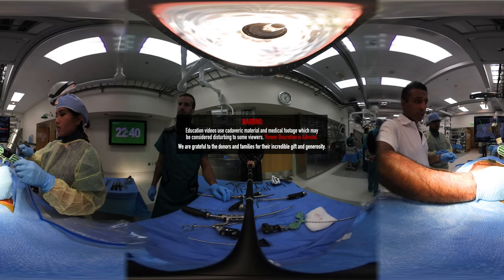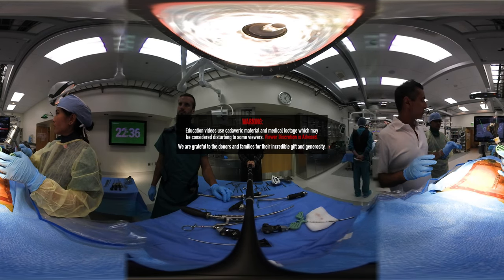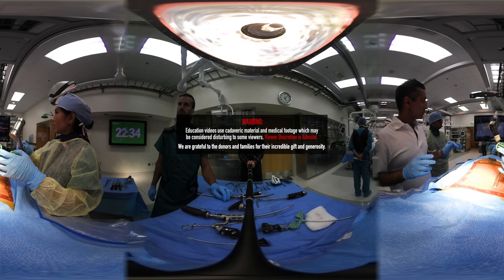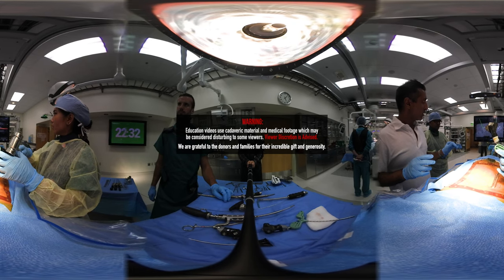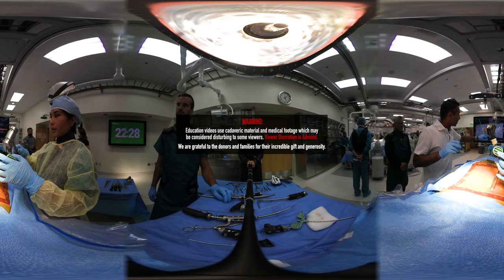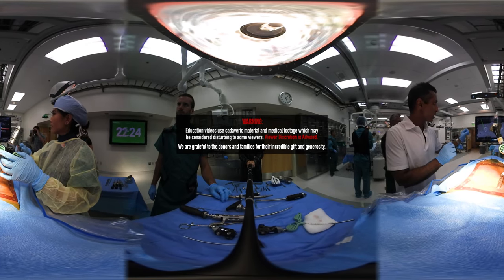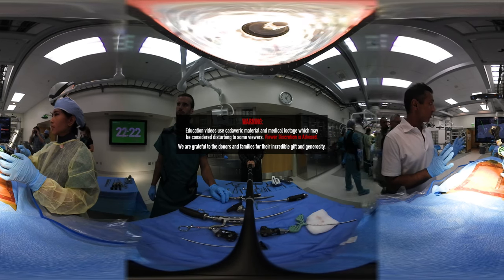Keep going. You can hold it. I'm going to let it go — you hold it so you get perfect. Keep going. A little bit more. You want to get this point to right about there. And on this point, you want to get it right about there. If you get those two points just right, then you're in the perfect spot.